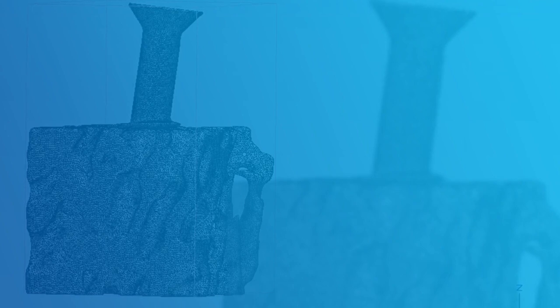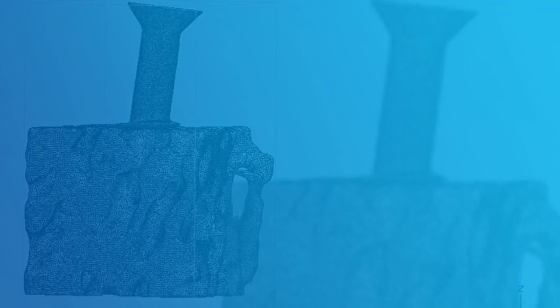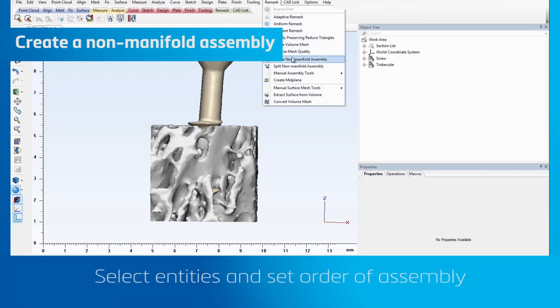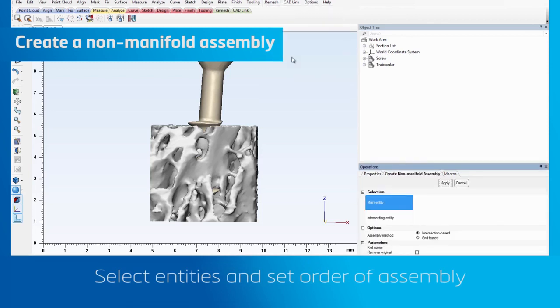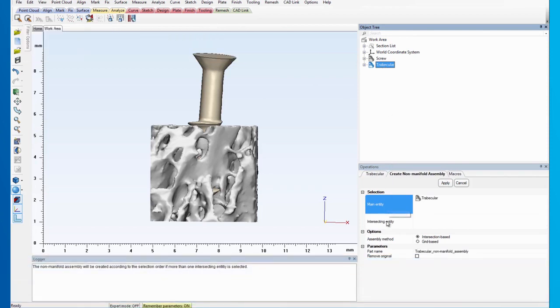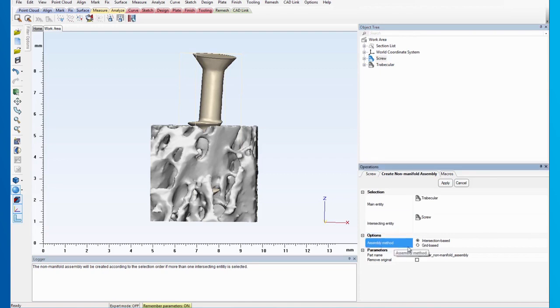First, let's create the non-manifold assembly. Go to the Remesh menu and click on Create non-manifold assembly. Select the trabecular as the main entity and the screw as the intersecting entity. Make sure not to do this the other way around, as it will change the boolean order between the parts.